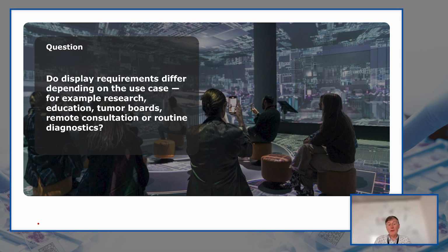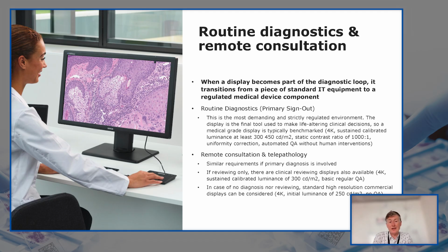Good point also. Of course, we start with the most obvious one, which is the routine diagnostics and the remote consultation. This is your diagnostic loop, so it mainly replaces your microscope. You're looking for a device that is medically regulated. That's important.